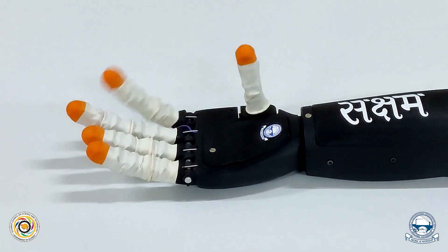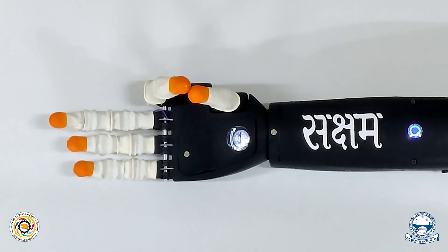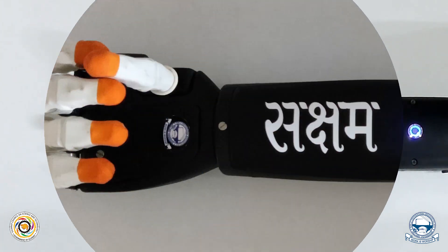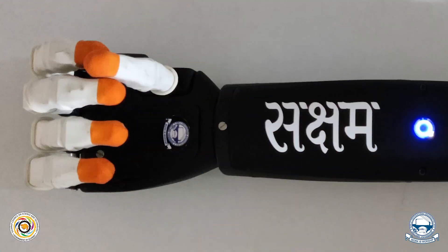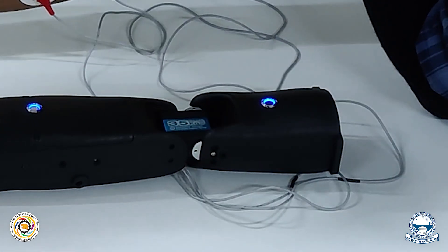Fingers are much more human-like. The thumb is designed to sustain high pressure and provide required flexibility at the same time by increasing its degree of freedom. The wrist joint is strengthened to minimize any structural damage. A socket is implemented for the amputee to fix their arm to the prosthesis.